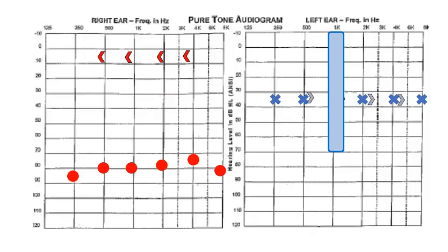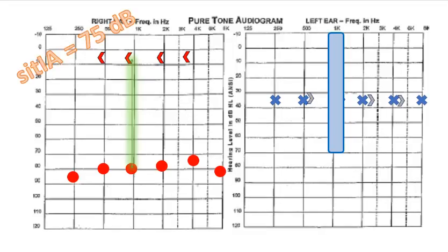What if bone conduction results are 5 dB in the right ear? Won't the 25 dB of crossover then overmask? The answer is no, because if the bone conduction result from the right ear was 5 dB, it would have a new SIT-IA value. Remember, the IA must be at least the same level as an air bone gap, unmasked or masked. With a new SIT-IA value of 75 dB, we have a potential crossover value of -5, and that means a 70 dB level of noise will be fully blocked to the left non-test ear side.